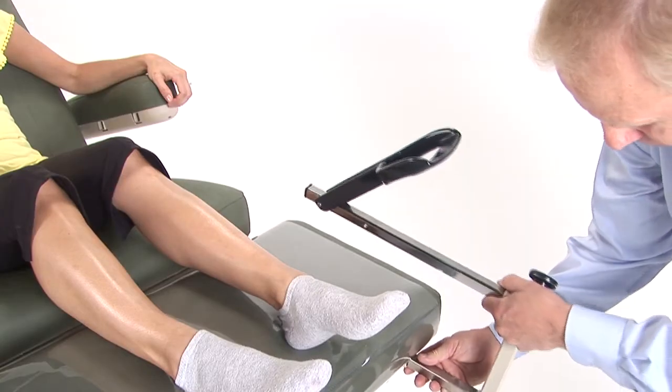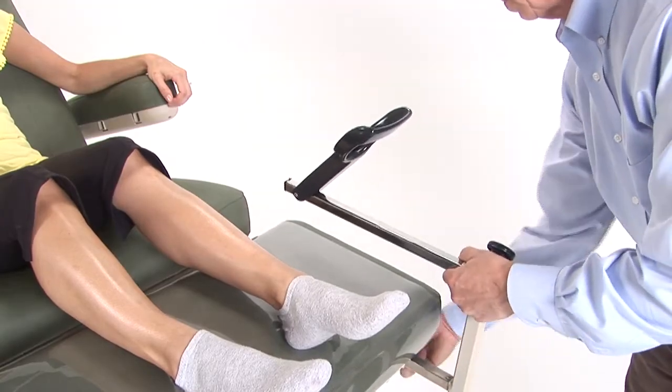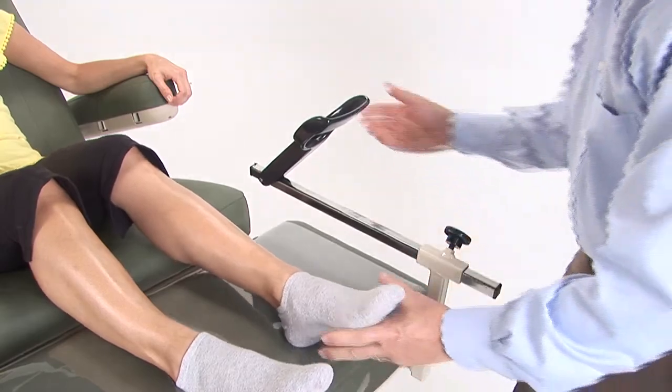The 90W can also be equipped with an optional adjustable plug-in foot stirrup that is very helpful when wrapping or treating legs.